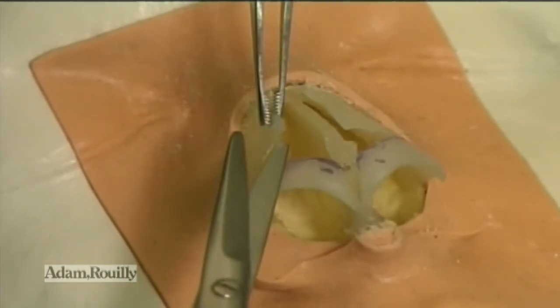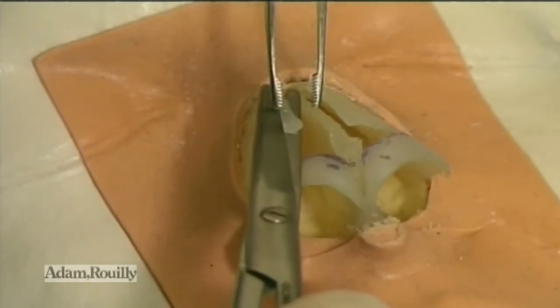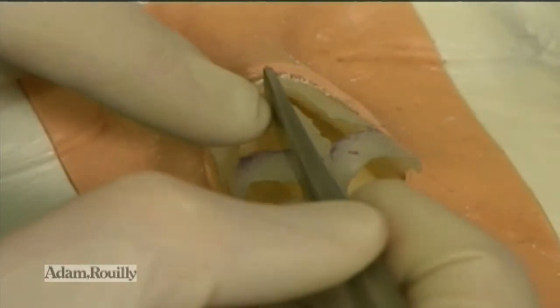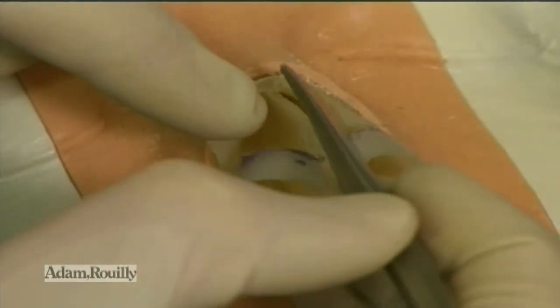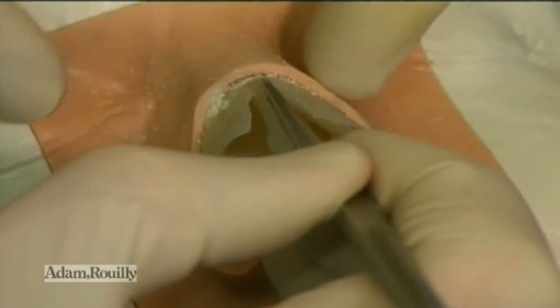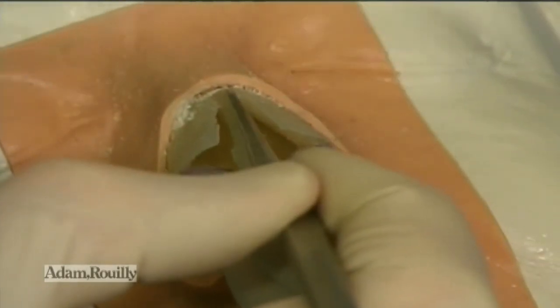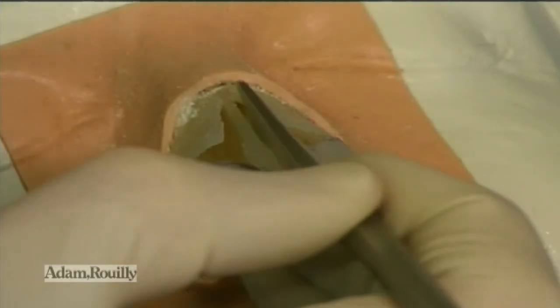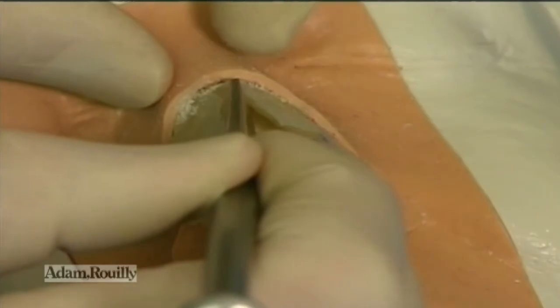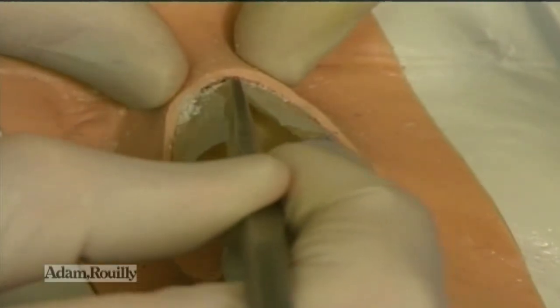We take the merest, smallest piece from each side. Next, we are going to perform superior medial oblique osteotomies. We are still going to preserve our support of the nasal vault, because we are not doing the lateral osteotomies yet. This will avoid disrupting our spreader grafts later on. We are heading towards the inner canthus, but not beyond.